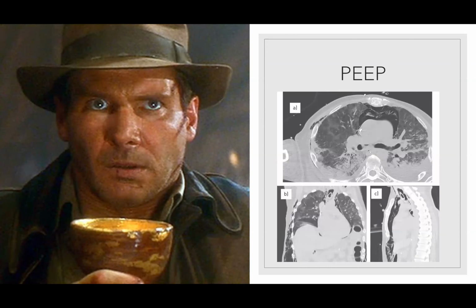Well, this is a CT showing an axial, sagittal, and frontal or coronal view of someone with ARDS. If you just look at the axial slice, we're at the feet looking up. This is the right side, this is the left side. Try and tell me what the optimal PEEP would be for this area of lung, as well as this area, which is air, causing a pneumomediastinum. And then this is almost normal, and this looks almost fibrotic. The idea of finding the specific PEEP for this patient is going to be very elusive.